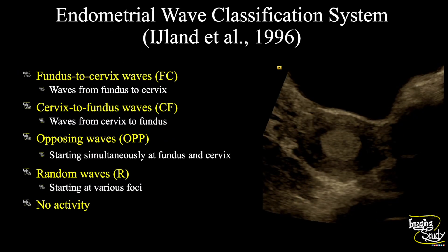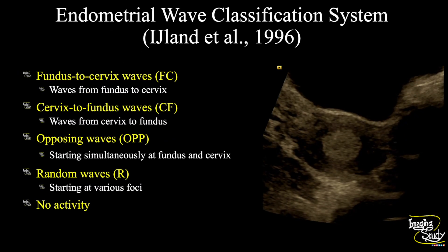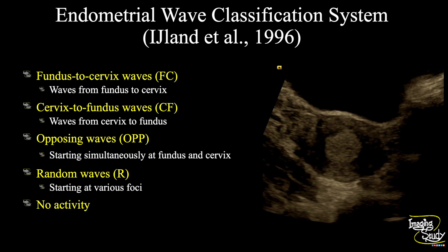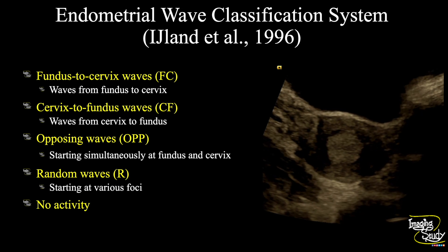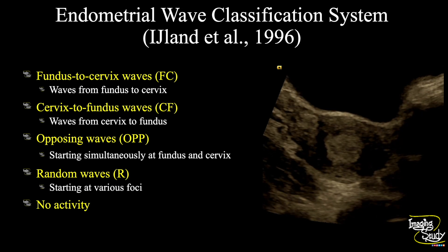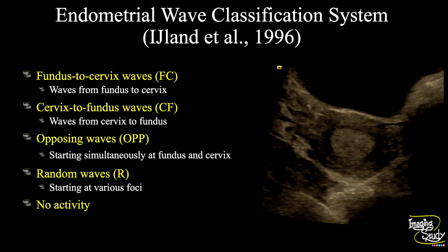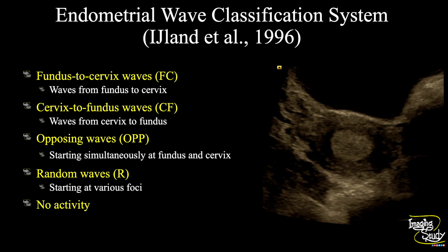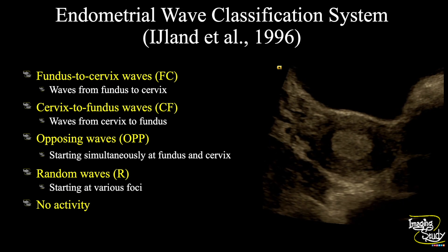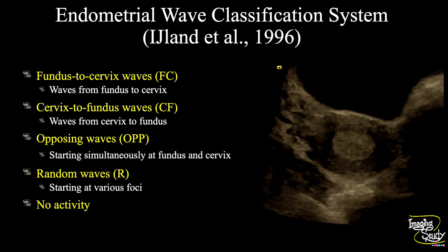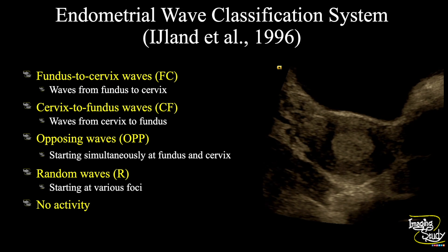We have five different types of wave classification: from fundus to cervix, cervix to fundus, opposing waves that start simultaneously at the fundus and cervix, random waves which start from various foci, and no activity.